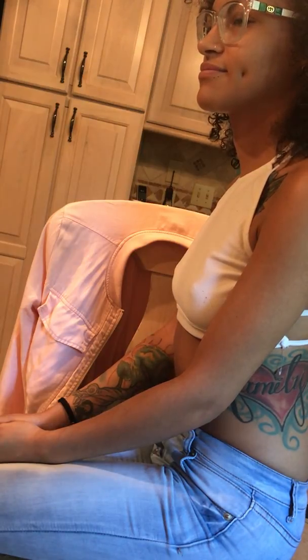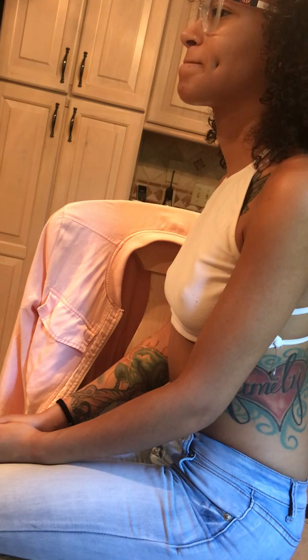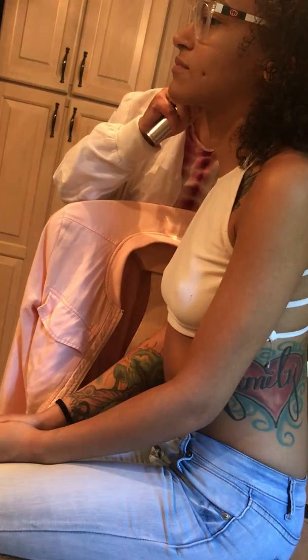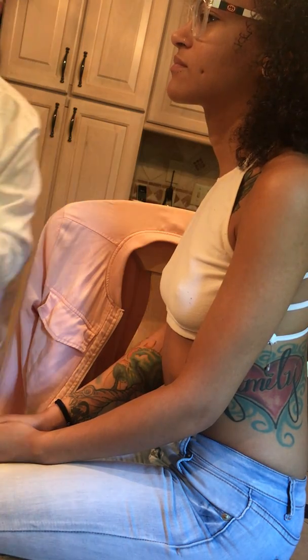It doesn't always snap on the way I want to. There we go. I'm going to pull her ear up and back. Oval, pearly white. No cerumen present. Tympanic membranes clear to all.